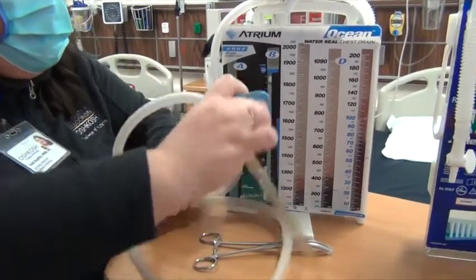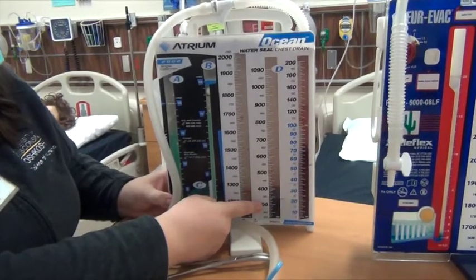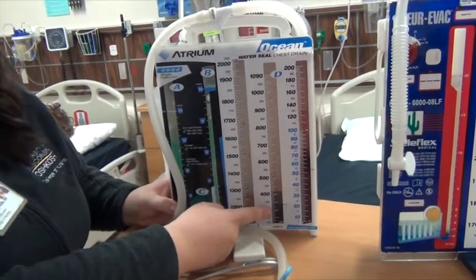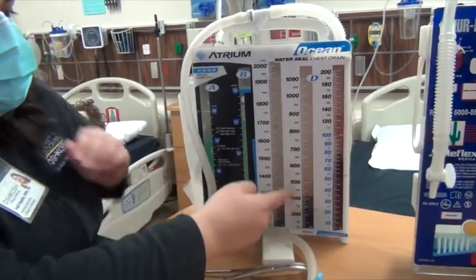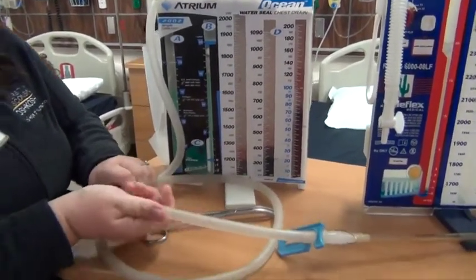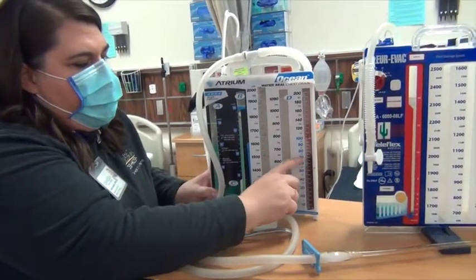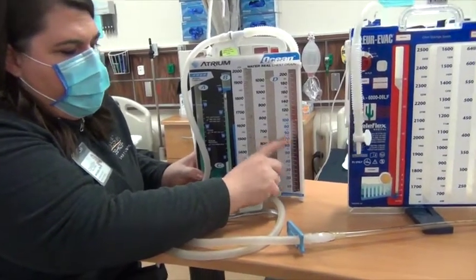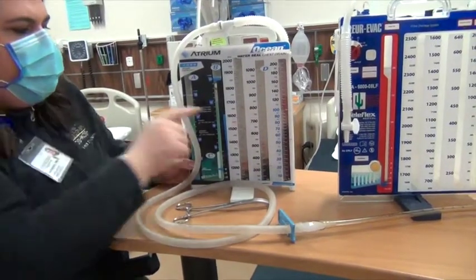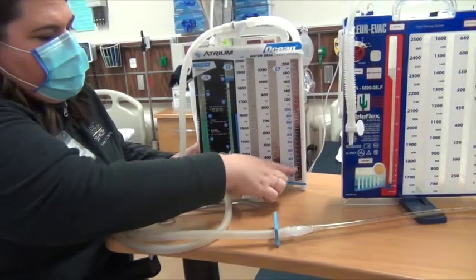in the tubing versus the color in here, because if it was darker red mixed with lighter red, that would be changing. It's kind of like mixing Kool-Aid. So make sure you're monitoring that here in the tubing. Here you would measure, we usually take a Sharpie and mark the time with our initials. Here. This one you can see how there's some in each chamber.